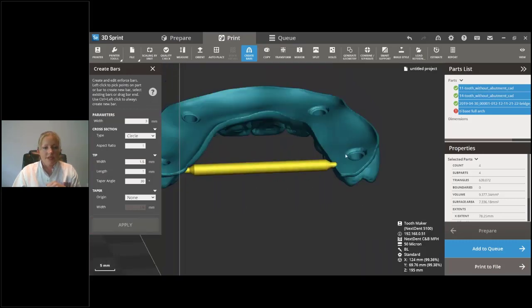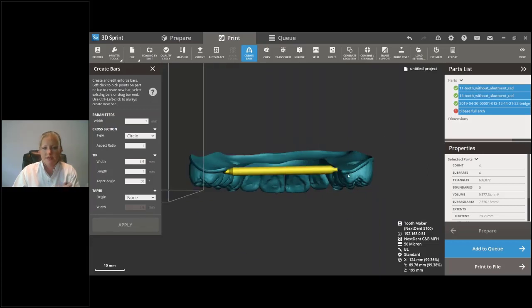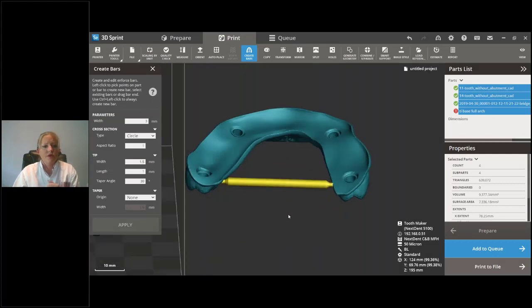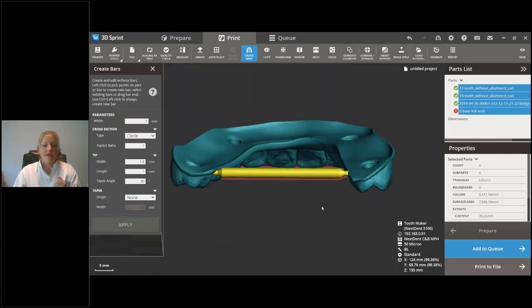And you can see that we made a real nice little tapered edge here. And so this actually just breaks right off, or you can smooth it off, obviously, if it's an area that's really important. Well, maybe a thin area like this might break off. So you might just cut it off.